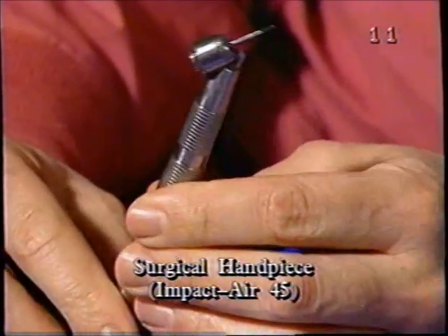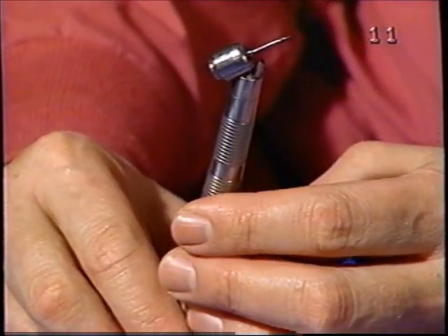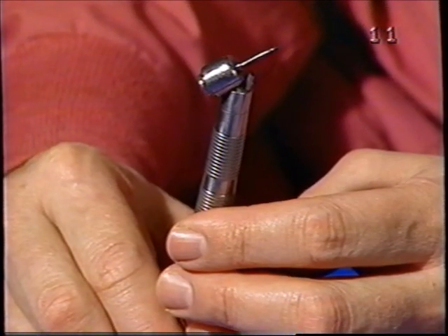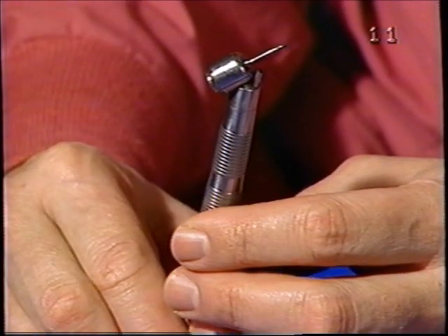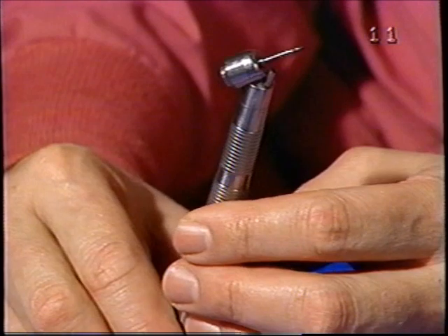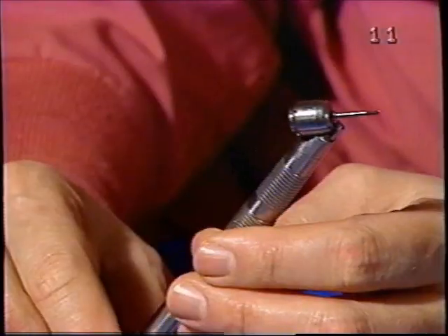Many oral surgeons are critical of general dentists doing surgery, and one example they use is that they use their conventional high speed and blow air into the surgical field, potentially causing air emphysema, which could be life-threatening, as air may get into the fascial planes of the neck and down to the mediastinum, causing mediastinitis. Well, we can get around that criticism by using a surgical handpiece.